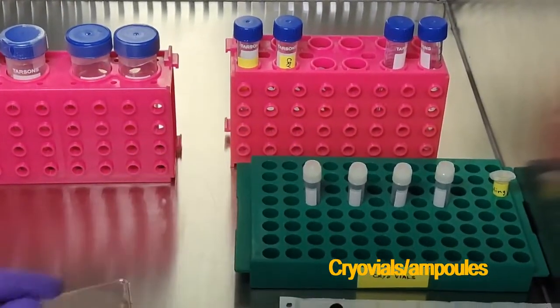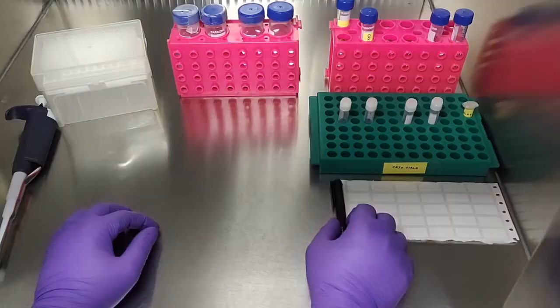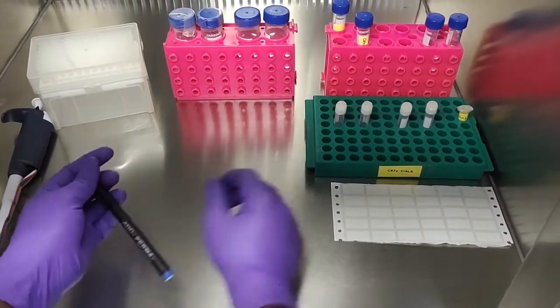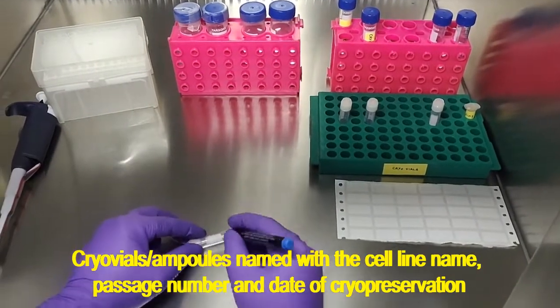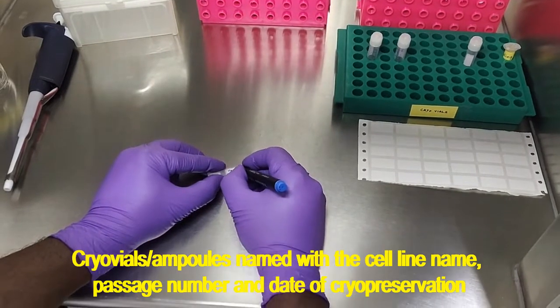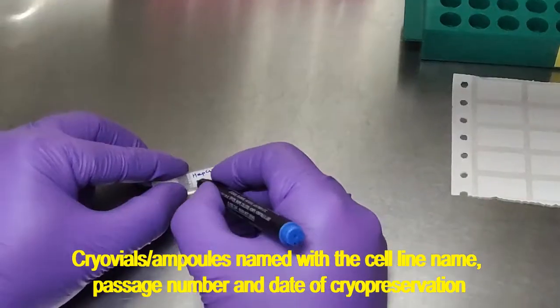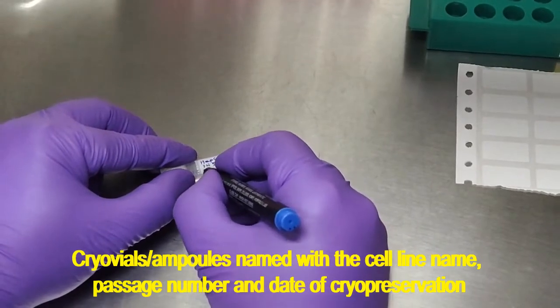The first step is the proper labeling of the cryovials. You need to properly write the name of the cell line, the passage number, and the date you are cryopreserving the cells.